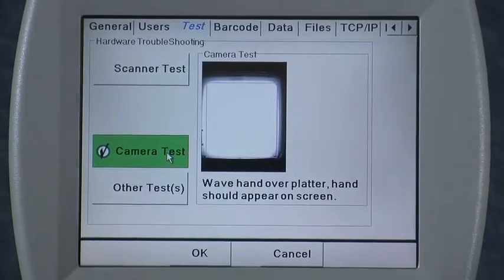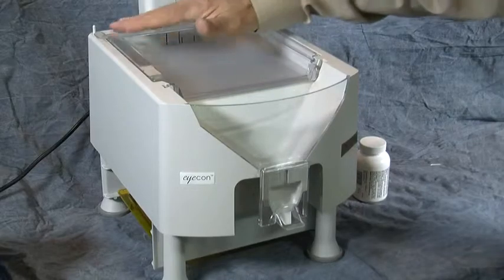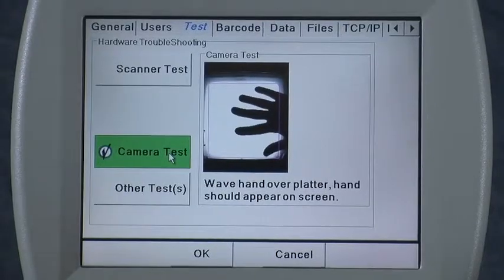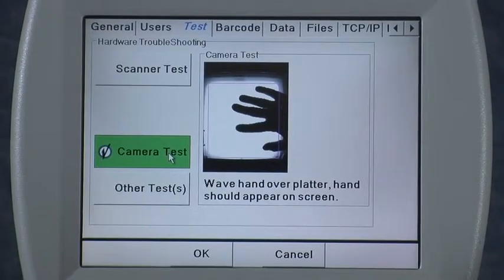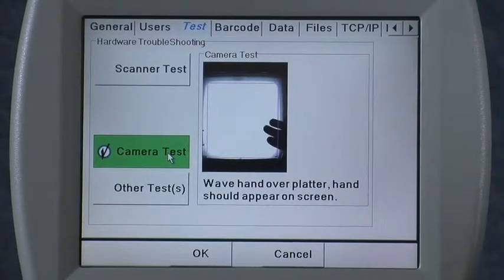The Camera Test is another feature we might ask you to go to if you call the factory for assistance troubleshooting any aspect of the Eyecon. It shows the picture of the pill tray. You can wave your hand over it to make sure it's taking a live picture, and you should see the purple rectangle on the screen which shows the counting area of the pill tray.